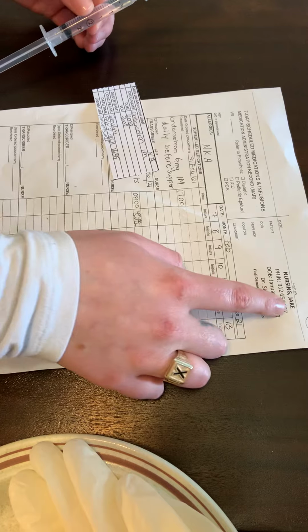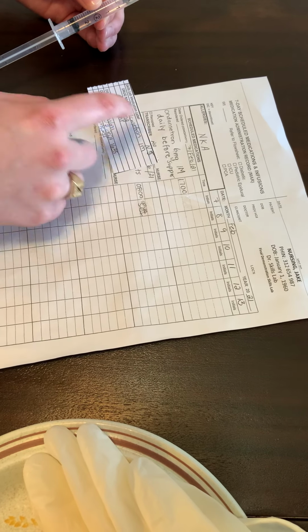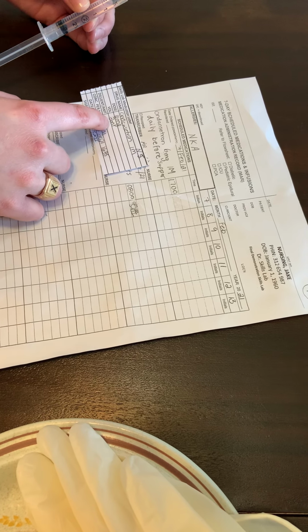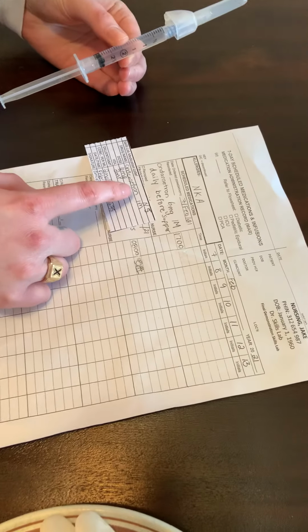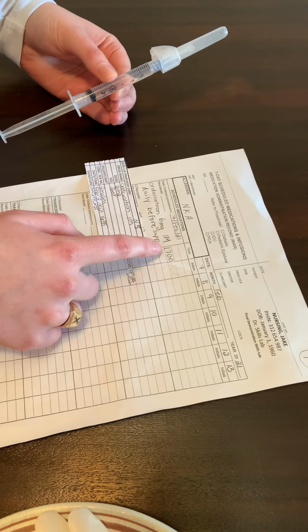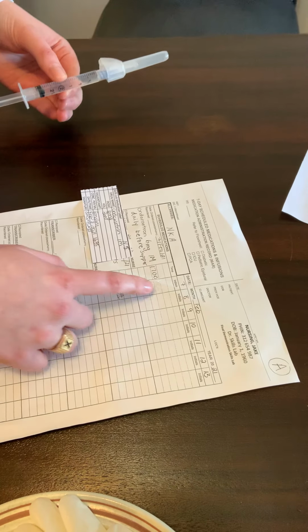Here we have Jake Nursing, ondansetron, 6 milligrams. The vial had 2 milligrams per ml, so we have 3 ml, and then we have 3 ml in here. It's given IM, it's an IM needle. It's given daily before supper at 1700 hours. It is 16:35 right now, so we're within that half-hour time window. It hasn't been given, so we will give it.